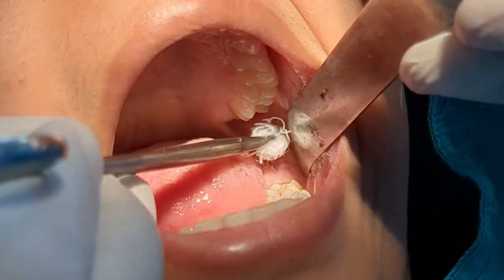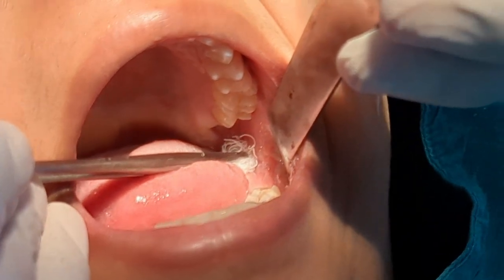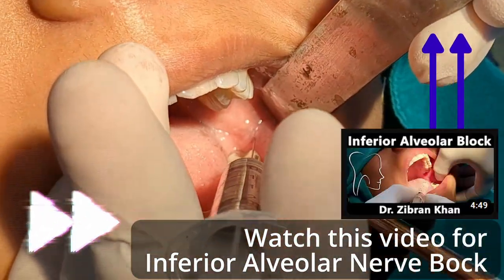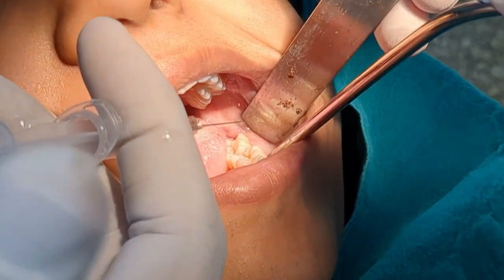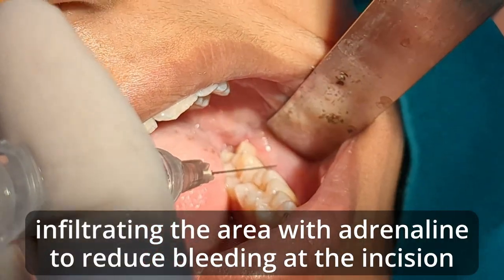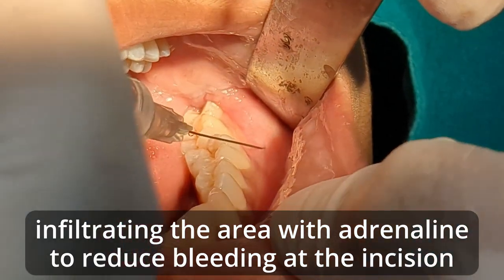I'm not going to explain the inferior alveolar nerve block here as I already recorded a video for that. This is a partially impacted tooth so I have to give an incision to take it out. For the incision, I'm going to give infiltration at the site of incision — I'm depositing the local anesthetic solution.